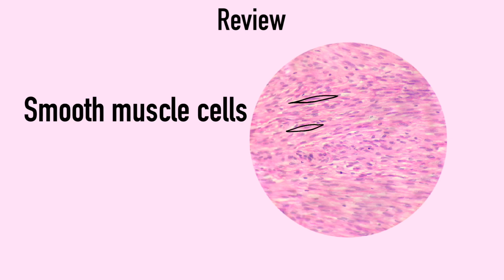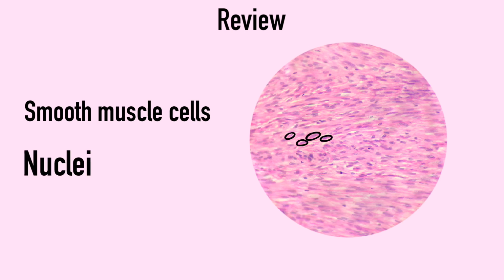Smooth muscle cells are fusiform shaped and do not contain a typical muscle tissue organization. And smooth muscle cells are mononucleated, with its nuclei being central.